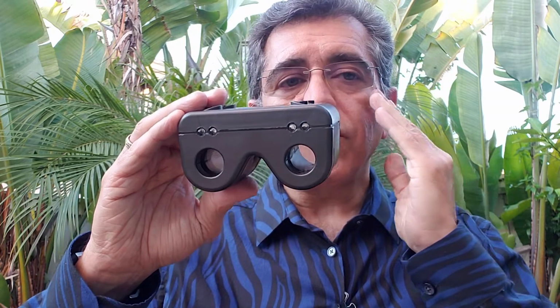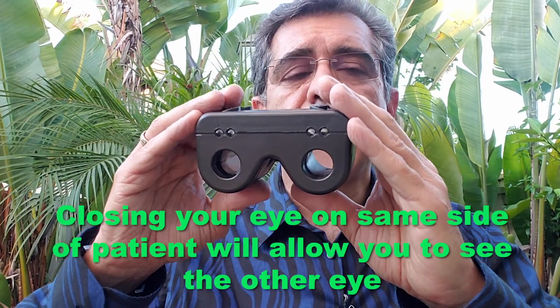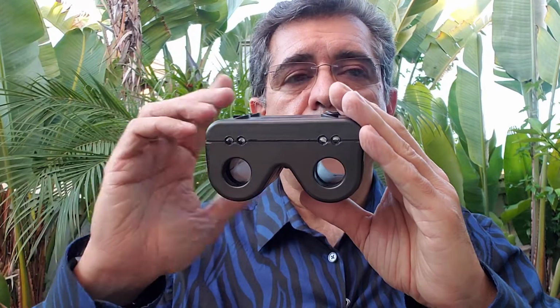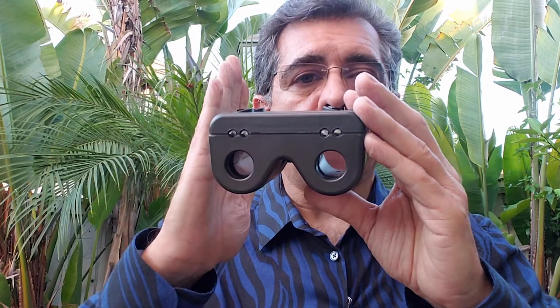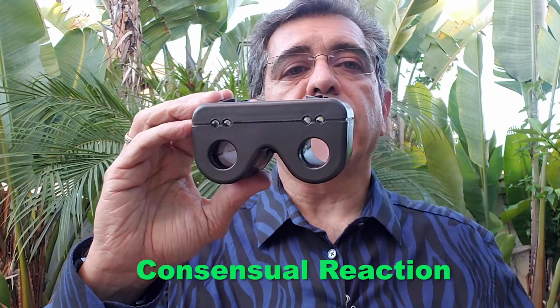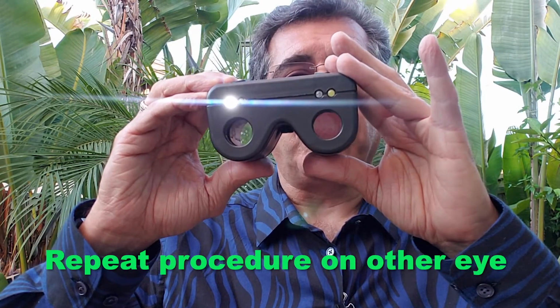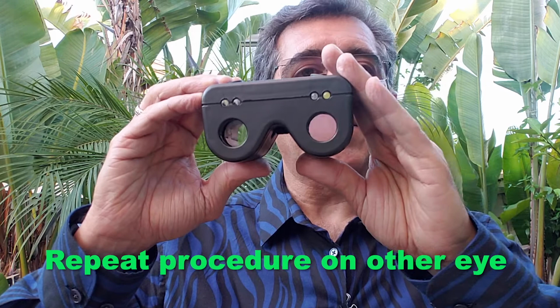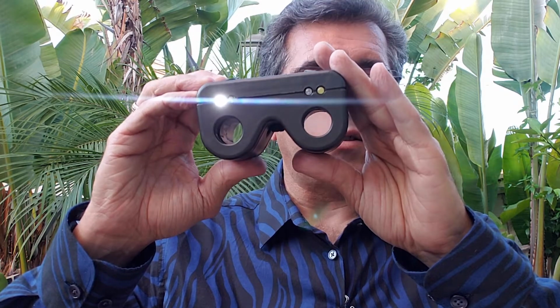If you can close your own eye of that same side, then you will be seeing the other eye of the patient. In healthy individuals, this other pupil also briskly constricts. This is called the consensual reaction. Then you can shine the other pupil and look for the direct response and consensual reactions.